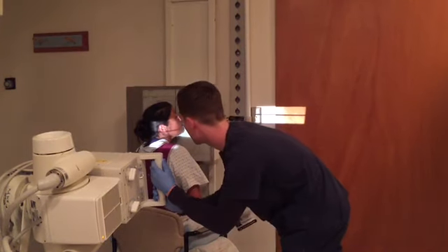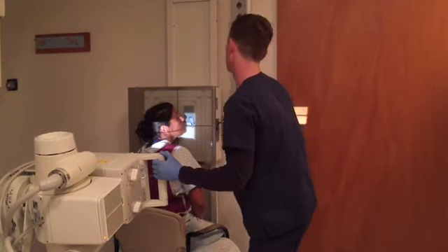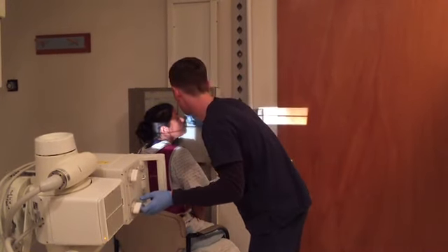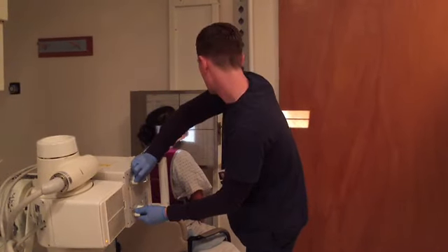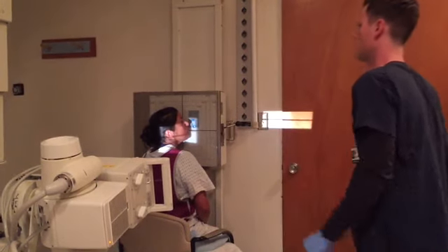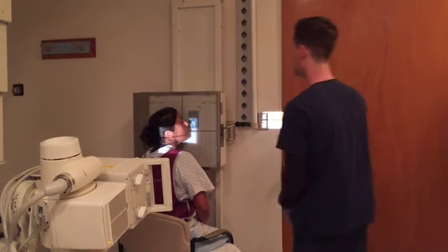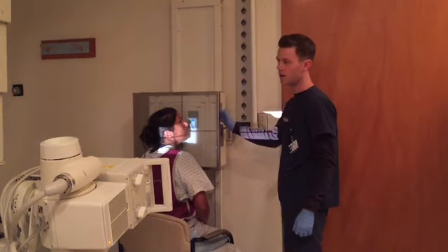Central ray still enters the same place. Yeah, that looks good. Keep the marker, come down, same technique. Go ahead and hold your breath, don't move, expose. Go ahead and breathe, run my cassette, bring in another one.